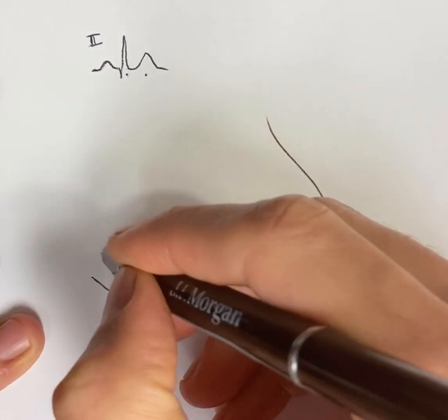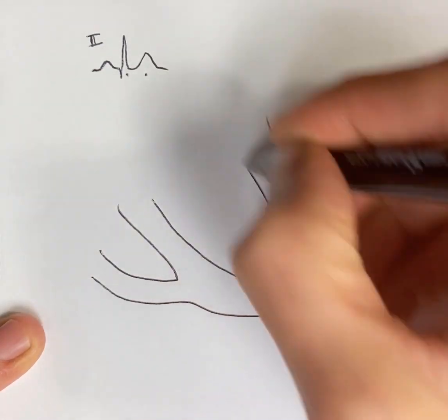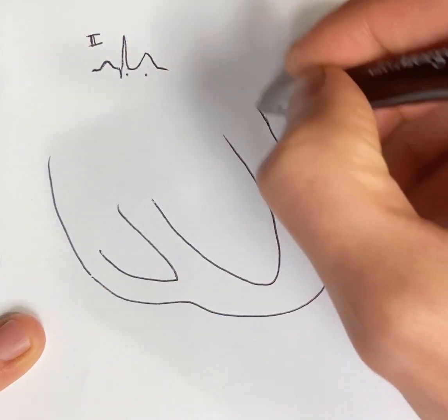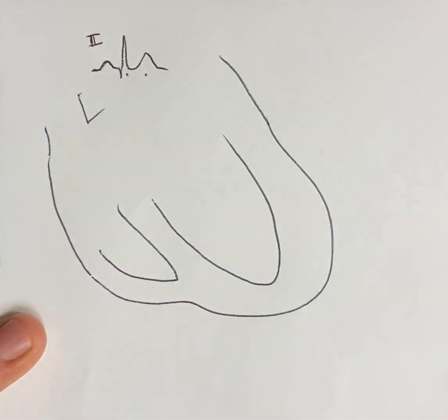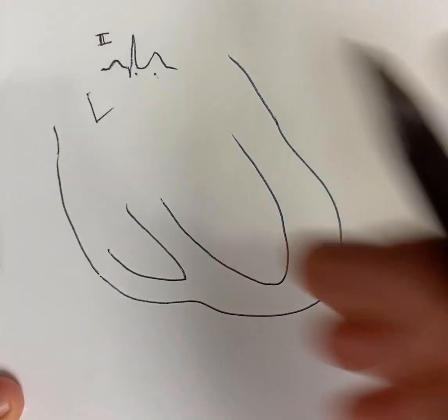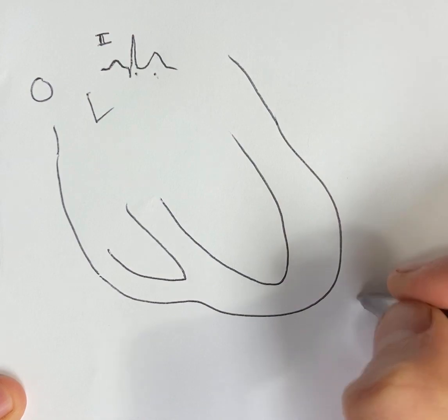So here's a heart, and before we talk about what goes on inside of it, let's remember how we even get these squigglies on the paper, which is that we stick these electrodes on the chest.